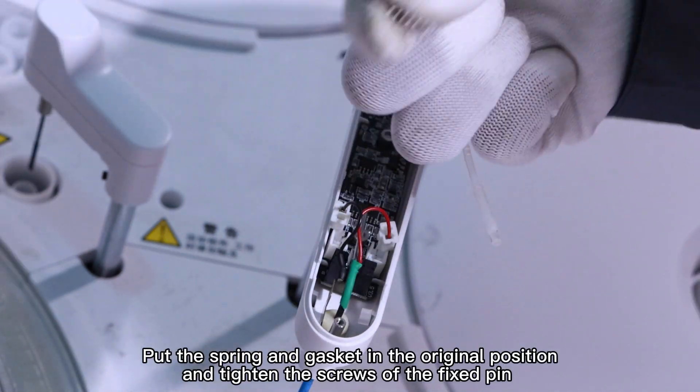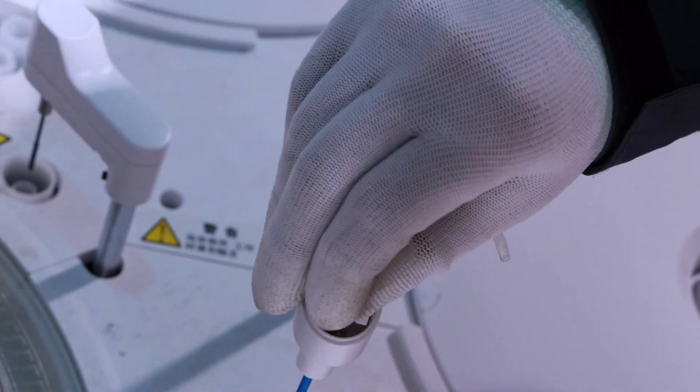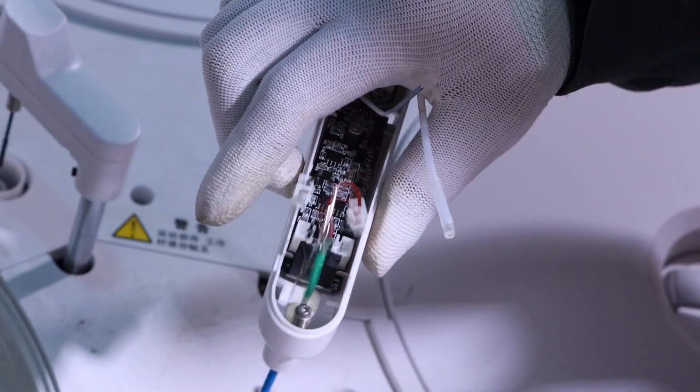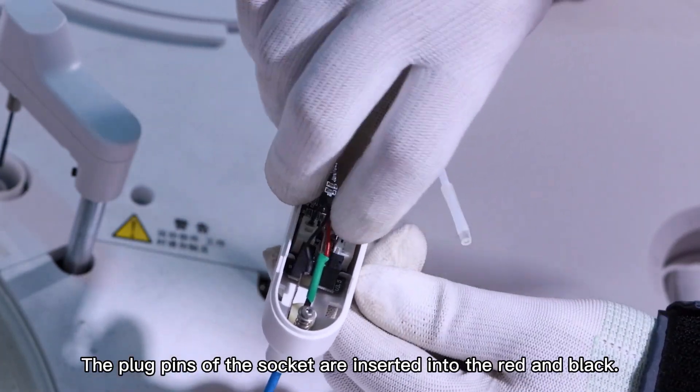Put the spring and gasket back in their original position and tighten the screws of the fixed pin. Insert the plug pins of the socket into the red and black connectors.